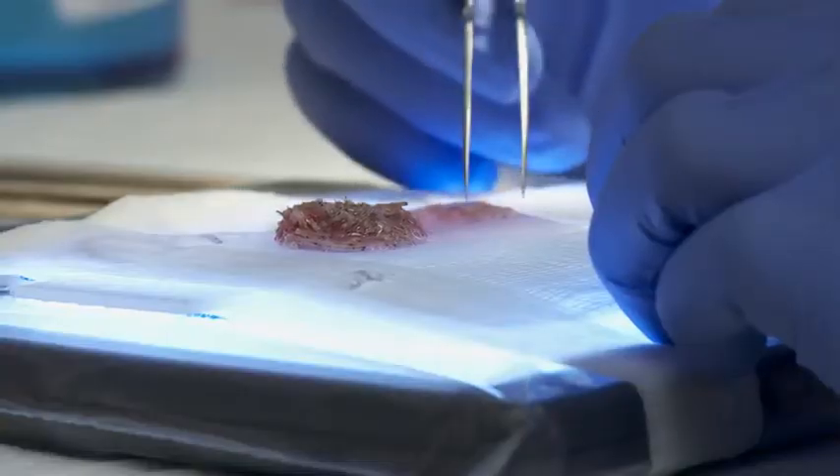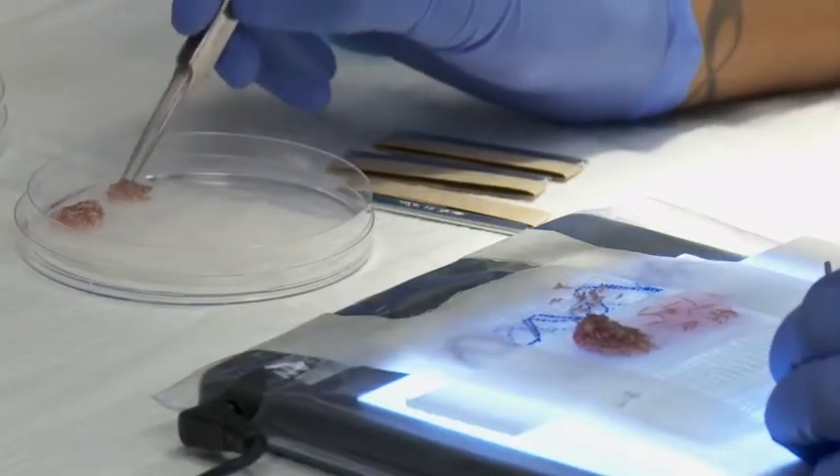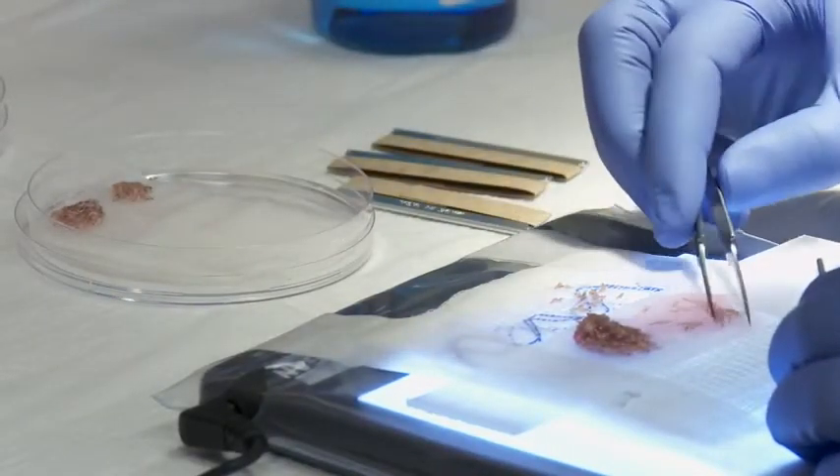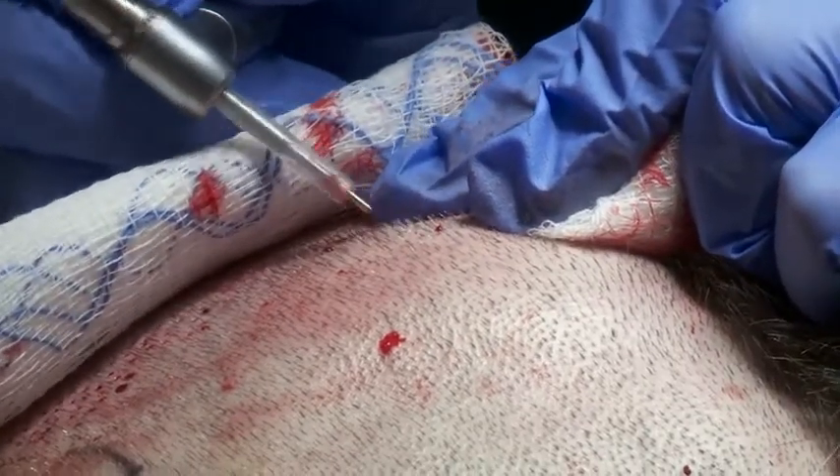When you're talking about graft health and graft survival, making sure that they're cold, wet, and not crushed are the three main things for making them grow. So the Neograft is a device that can help us to do that.